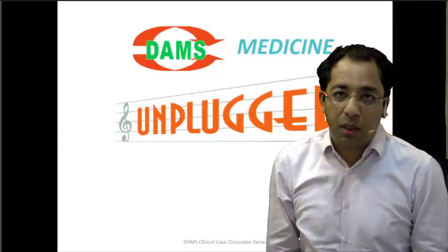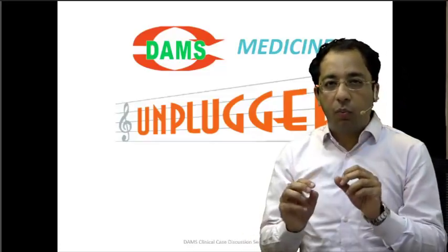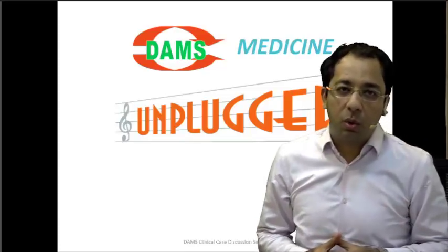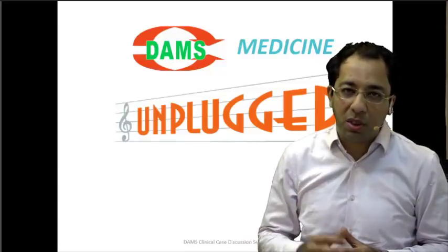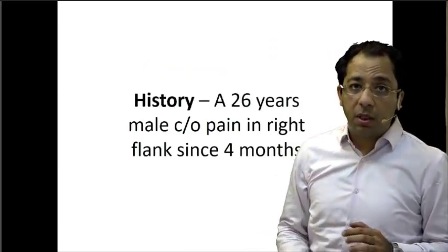Hi friends, in today's episode of DAMS Unplugged, I'll talk about a newish kind of update in urinary tract imaging. Although I would not exactly say it's new, but from an undergraduate perspective or a postgraduate perspective, it's also an important thing today. Now, let me show you the image and the history here.